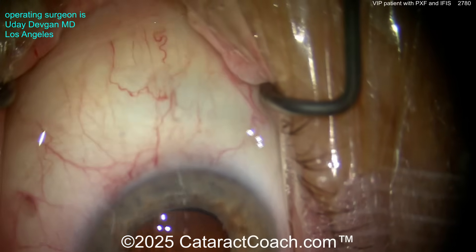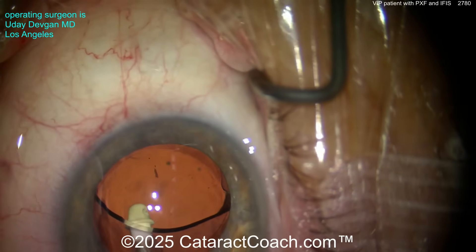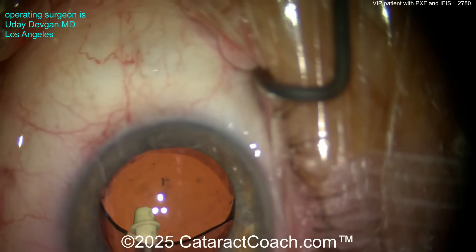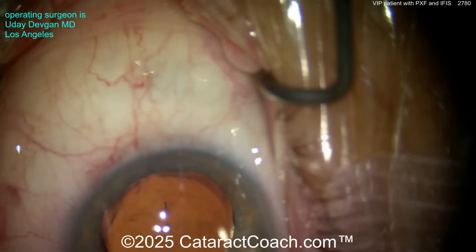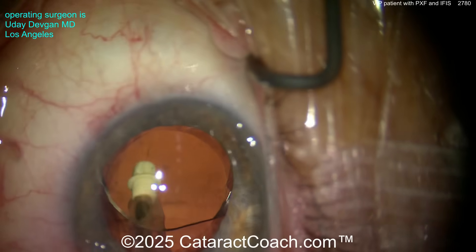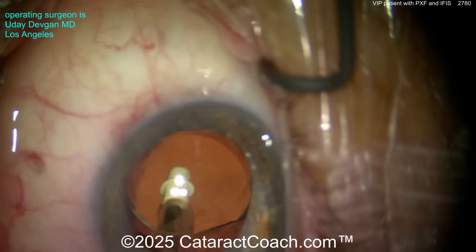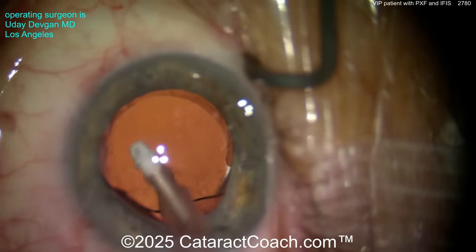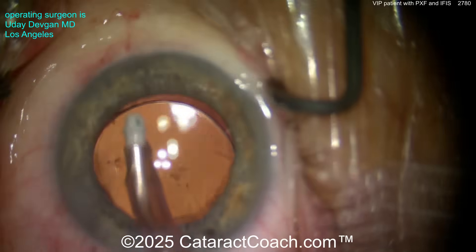Let's go behind the optic and remove the viscoelastic. Can I get any of that posterior smudgy stuff off the posterior capsule? Let me try — I'll be gentle, but I don't want to risk a capsule break. The vast majority of the posterior plaque from the PSC has been removed. Do I want to risk it? No. The better part of judgment here is to be a little more conservative. I try to remove it — it just doesn't want to come. I try to aspirate it, I'm scraping it, but we're doing fine. Let's keep the lens in good position, take out the rest of the viscoelastic, and call it a day.